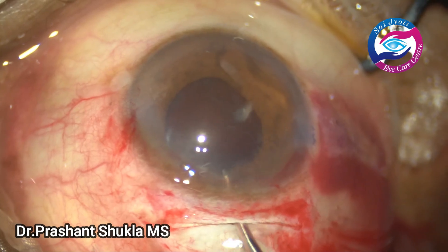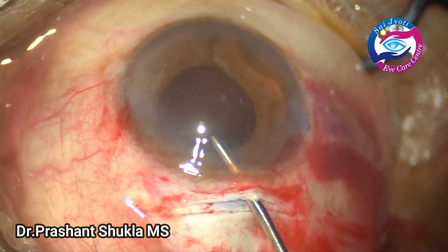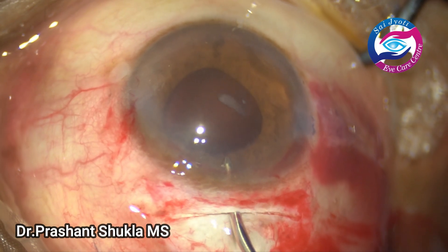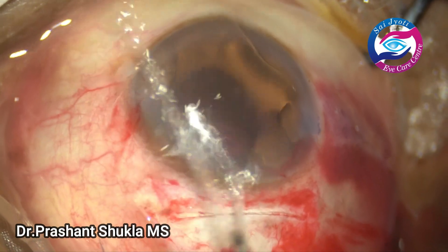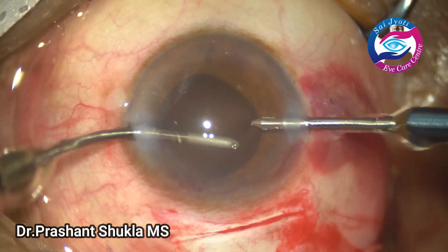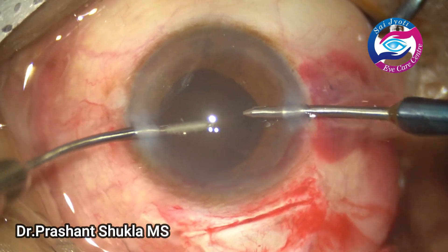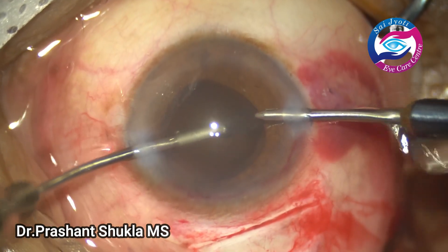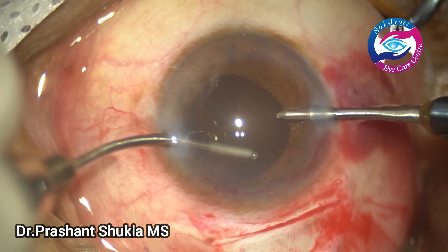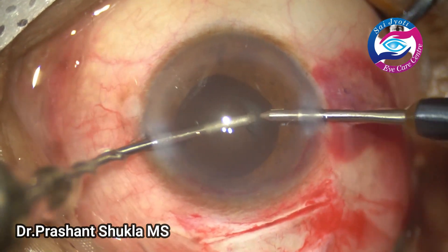Now is the time to remove whatever cortex and epinucleus remains by flushing the anterior chamber using an irrigation handpiece. There is very little cortex and I am going to remove it using bimanual. To use bimanual in small incision cataract surgery one has to have a very good wound construction so that the wound doesn't leak.